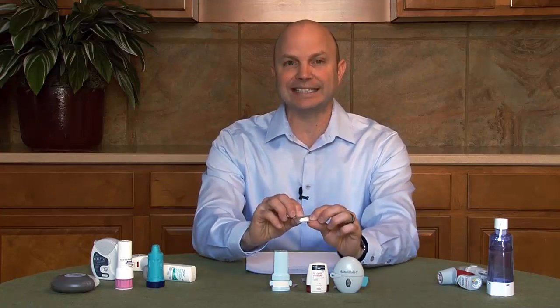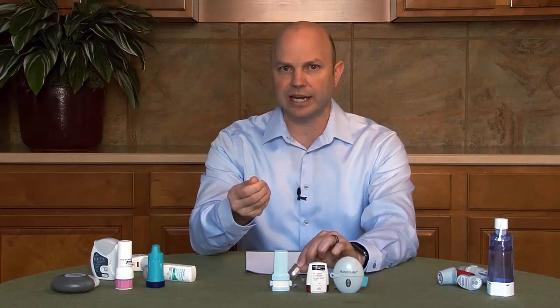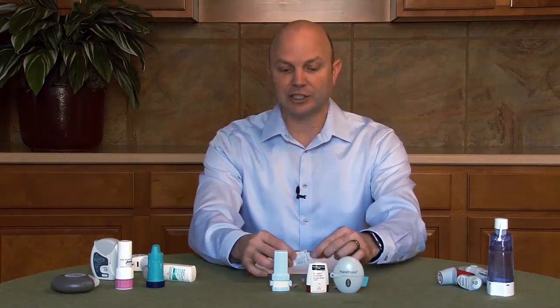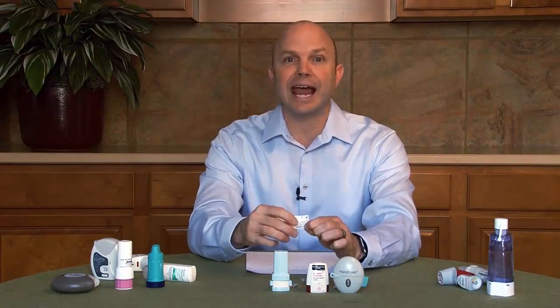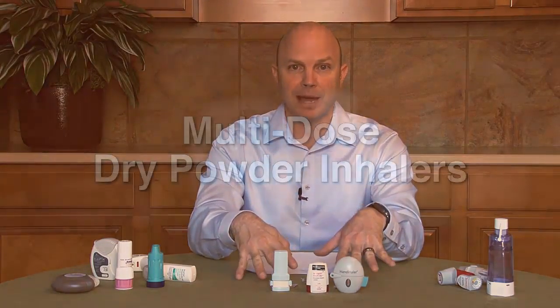Another thing to note with the capsule is that the medicine inside may cause a skin irritation, or if you touch your eyes, might cause your eyes to become fixed and dilated. So it's always a good idea to wash your hands before and after you take all of your medications. And the medications that will cause the dilation of the eye are known as anticholinergics. But again, it's a good general practice to wash your hands after using any of these blister packs.